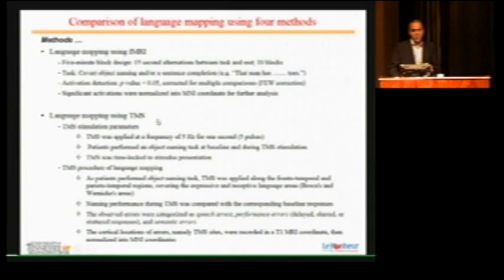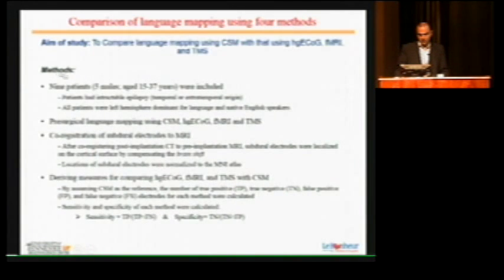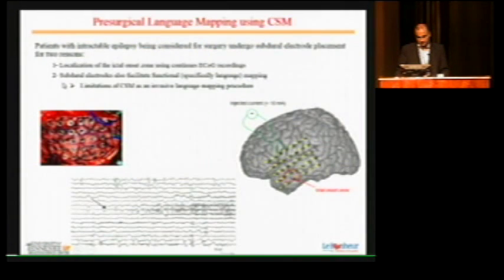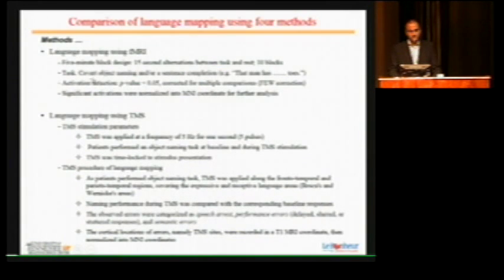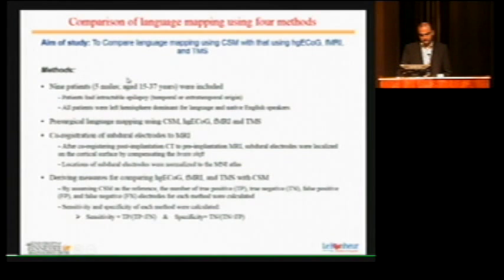For fMRI, we pretty much used our clinical standard procedure for pre-surgical language mapping. Our paradigm was a 5-minute block design.